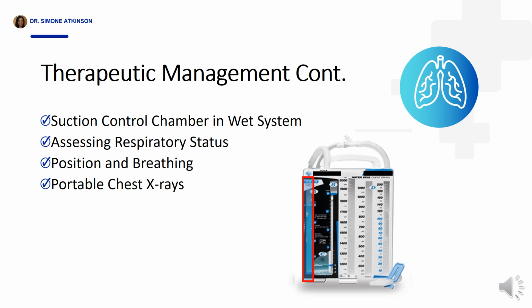And avoid milking or stripping the chest tube unless specifically directed by a healthcare provider to do so, and you're also permitted by your agency to do so, because these actions can lead to changes in the pleural pressure and damage the lung tissue.